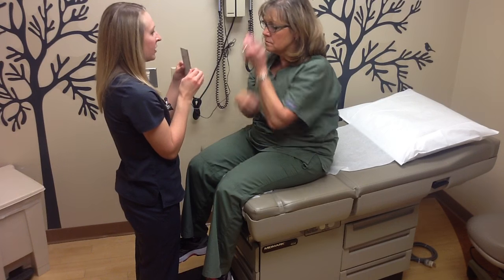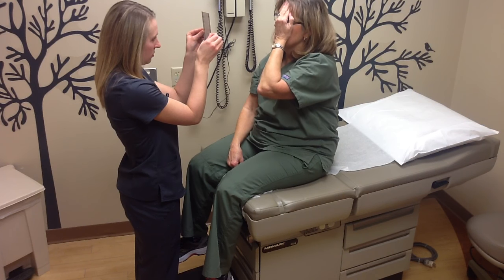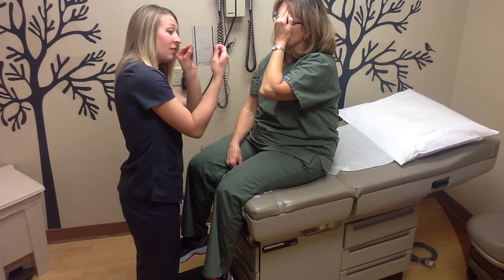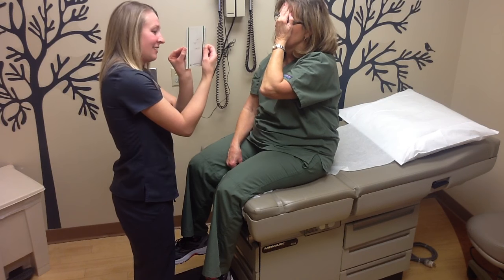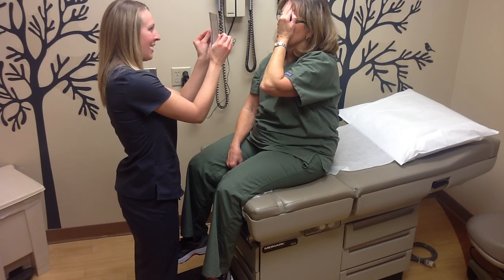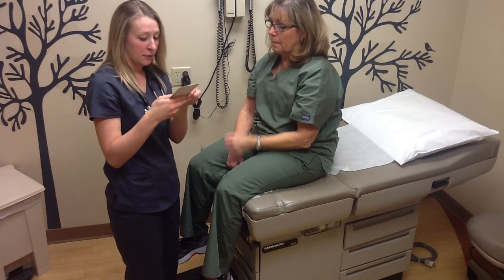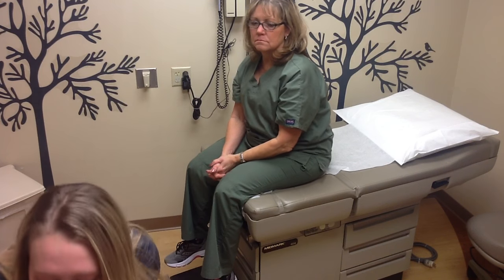Okay. Now if I can have you cover the left eye. 8745. Sorry, I was doing the line by line. 62925. Again. 63925. Good. So Sandy has 20/50 vision bilaterally.